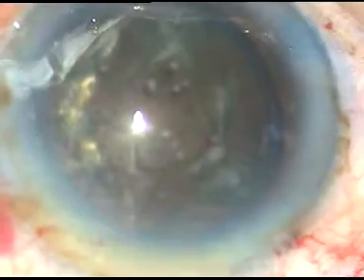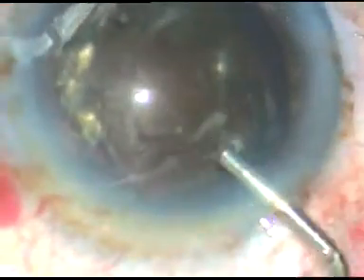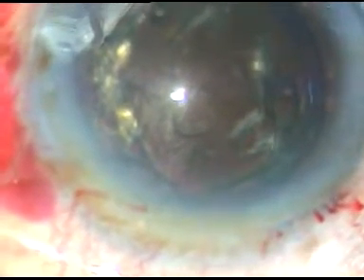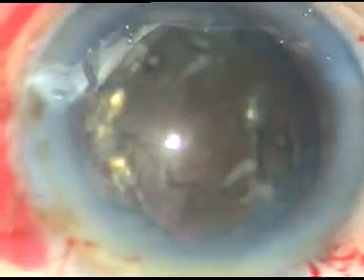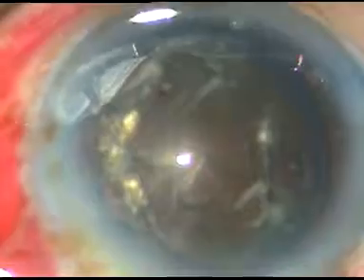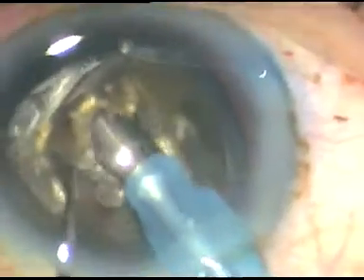We are now ready to use the phaco energy to conquer this hard cataract. The machine being used is the Alcon Centurion phaco machine from Switzerland. I am going bevel-down in Phaco 1 mode with 90% phaco energy, flow rate 25, and vacuum 70 mmHg.